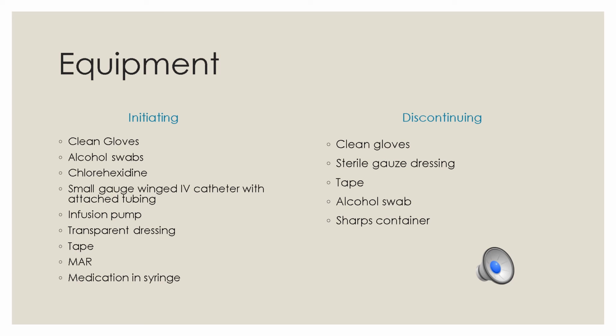When we discontinue the continuous medication in the subcutaneous tissue, we want to have clean gloves, sterile gauze dressing, tape, alcohol swab, and a sharps container to dispose of the needle.